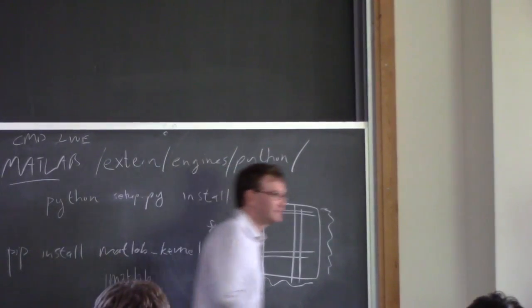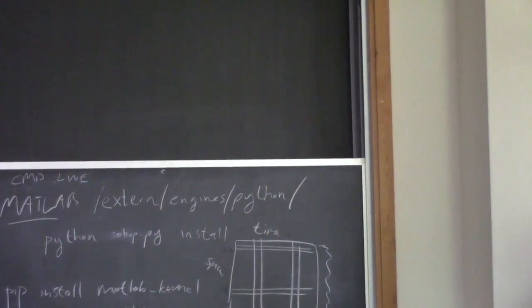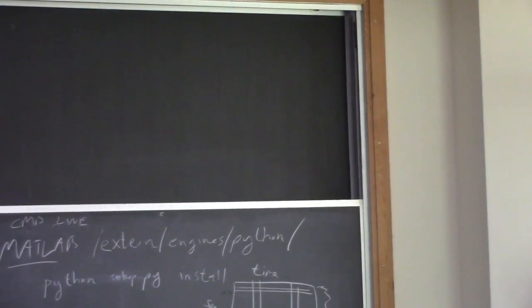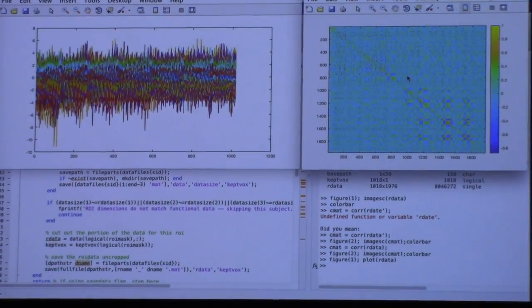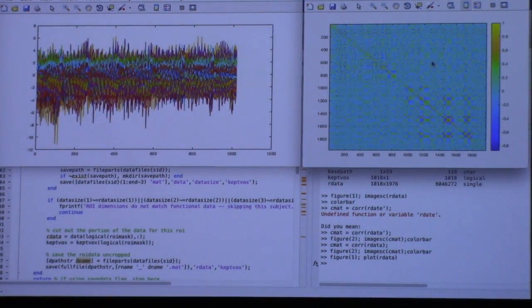The upshot is that when you have a time-time correlation matrix, so you're calculating pattern correlation between every pair of time points in your stimulus, you shouldn't take the absolute value of these correlations too seriously. Because you've done this demeaning, and you kind of had to do it, that pushes around the correlation values, and some of them are now going to be negative. In the original data, all of them were positive, like 0.99.